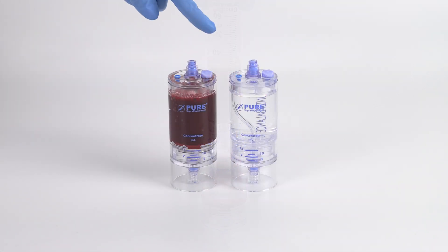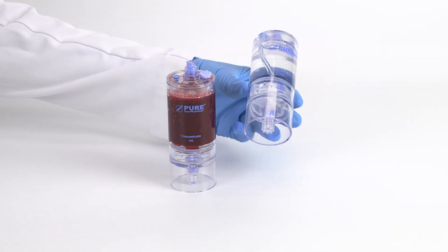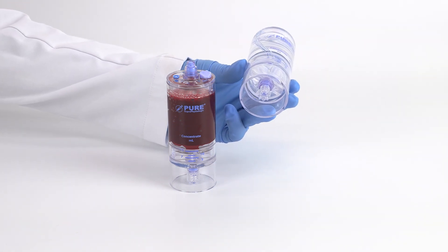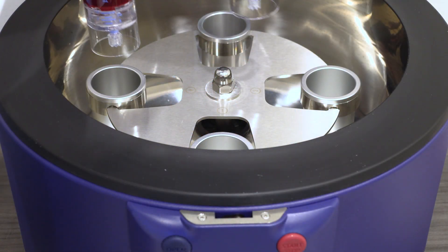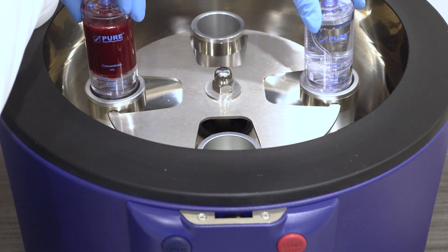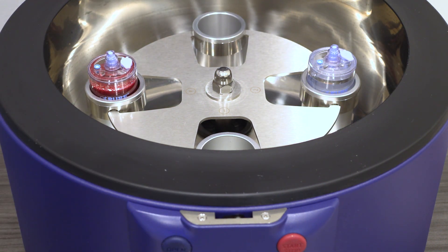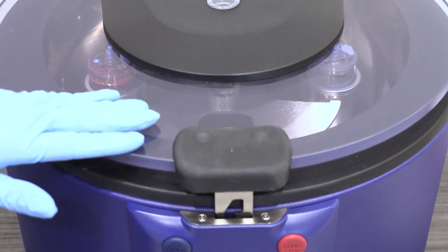When completed, close the vent. Use the counterbalance device to counterbalance with equal volume. Be sure to always place the clear non-vented cap to the bottom port of the counterbalance device as well. Place both devices in the centrifuge rotor at opposite ends. Follow the protocol settings provided in the IFU insert, close the centrifuge lid, and press start.